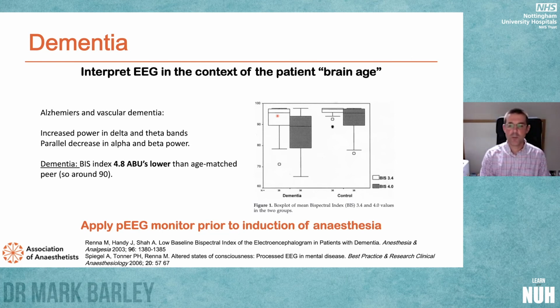So I always put my BIS monitor on before the patient goes to sleep. It's a wonderful talking point. Patients, I think, are quite impressed by it. And they always say, oh, you won't find anything in there, doc. Which lightens the mood a little bit.